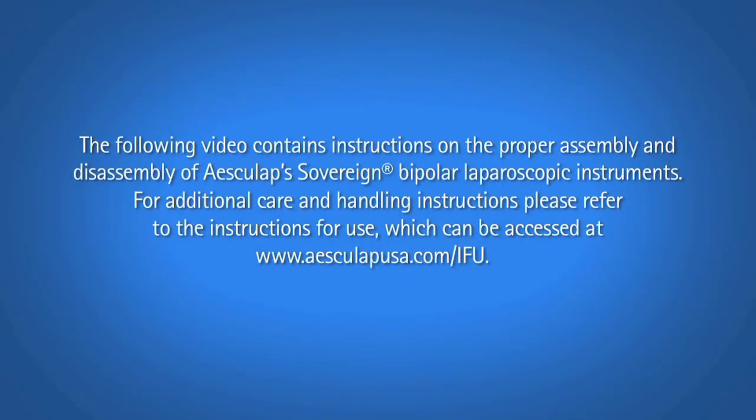The following video contains instructions on the proper assembly and disassembly of Aesculap's Sovereign Bipolar Laparoscopic Instruments. For additional care and handling instructions, please refer to the instructions for use, which can be accessed at www.aesculapusa.com/IFU.